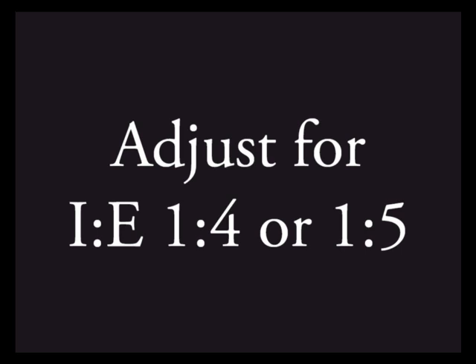You want to give them a long time to expire. The pathophysiology of asthma or COPD is that they can usually get air in until their respiratory muscles are really tired, but they can't get it out because there's those bronchial obstructions. So they get air in, they can't get it out. That leads to their lungs being overinflated, and if you keep popping air on top of that, that's where you lead to problems like pneumothorax and barotrauma. So if your ventilator has the ability for you to see an I to E ratio, this is what you want to see. Greater than that is fine. Less than that, probably not so much.